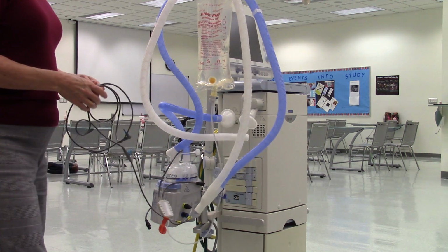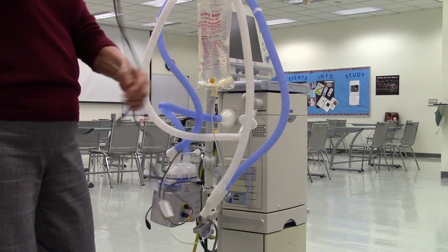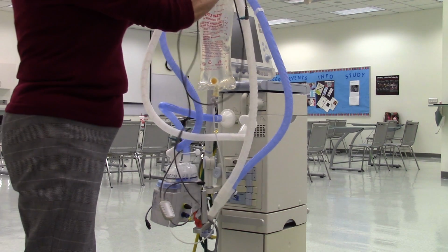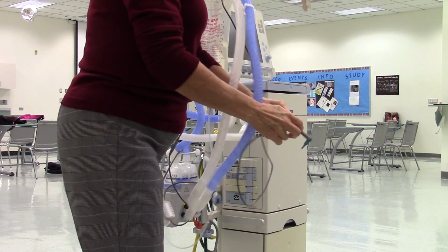That's expiratory. What are those cables for? Temperature sensor. Oh, temperature. Yeah, so this will sense the temperature of the gas. Then you connect that to the temperature sensor? Yes, the temperature sensor port. Interesting. Everything's coming full circle.